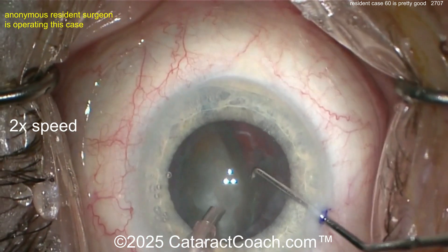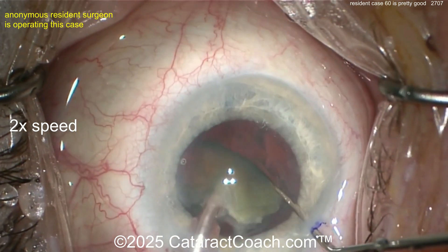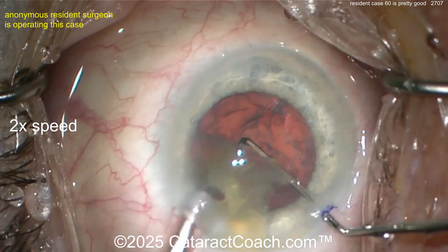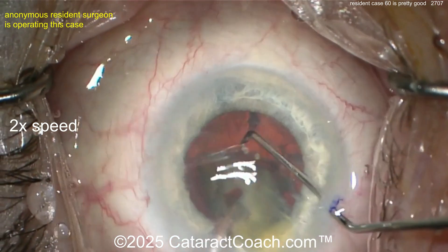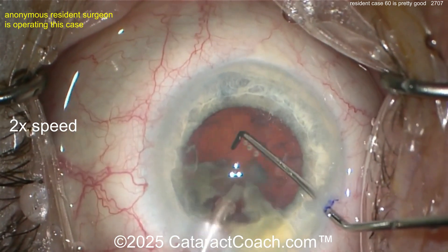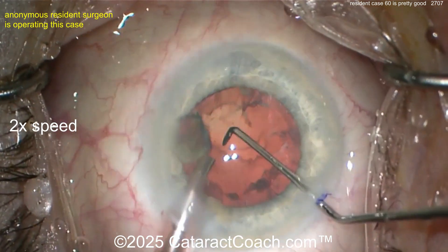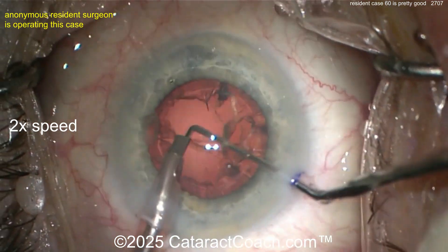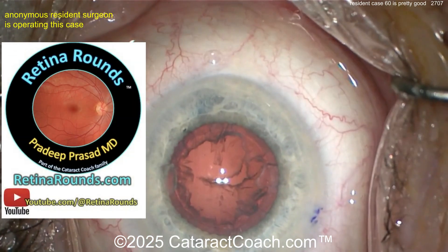Here's the last piece — be careful. That piece comes up; remember nothing's weighing down the capsule or bag anymore, so be careful — the capsule or bag could come up. This is the last quadrant coming out of the eye, nice and easy, chopper in that safe position. That's pretty good — you're doing a good job here. The technique looks pretty stable, good choice of fluidic settings, not too much bounce in the anterior chamber.